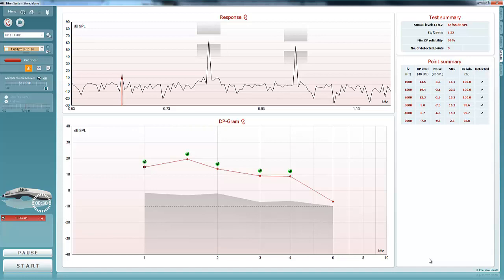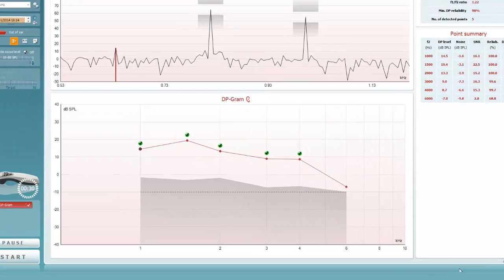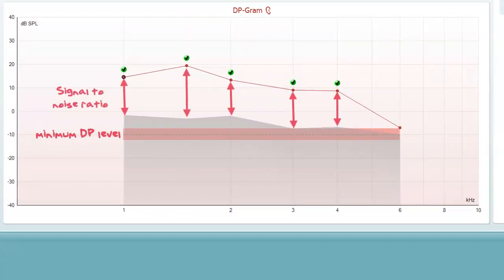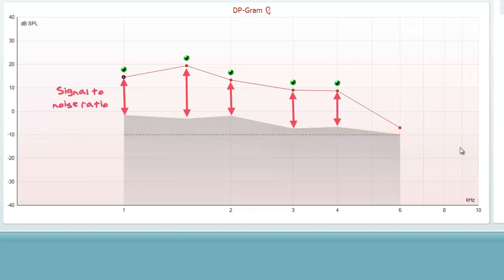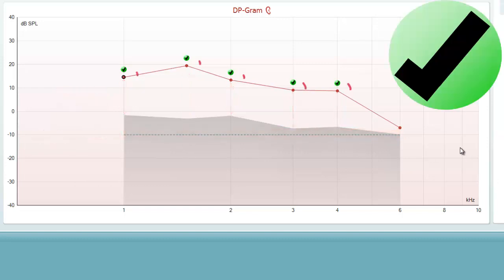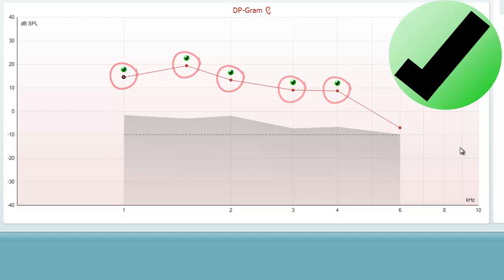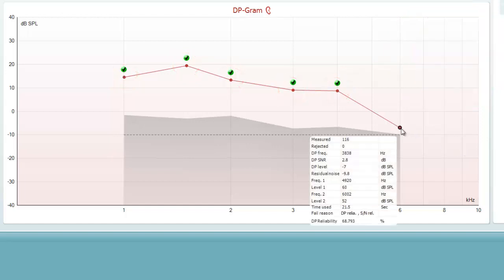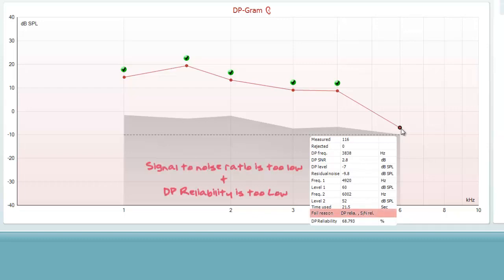The DP gram displays the OAE data graphically and shows the minimum DP level as well as a signal-to-noise ratio. A green check will appear above each frequency if the pass criteria are met. If this does not appear, then hovering over the point will show the numerical data associated with the point. At the bottom of this information, the failure reason is mentioned.